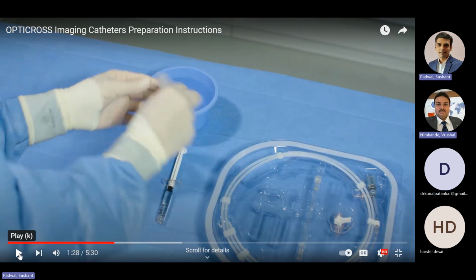So to ensure that there are no micro bubbles attached to the wall of the syringe, they do it 2-3 times. Whatever lubrication layer is there will be completely taken off, and the micro bubbles will not stick on the inner wall of the syringe. If you watch how they fill the second syringe, you will realize that.